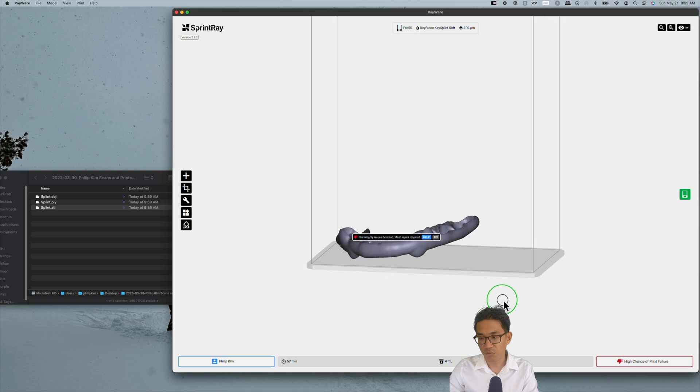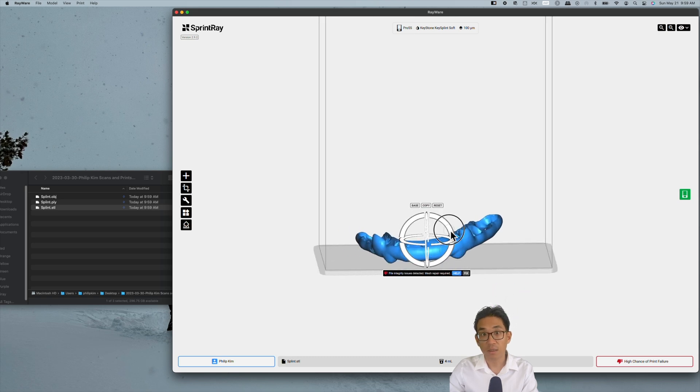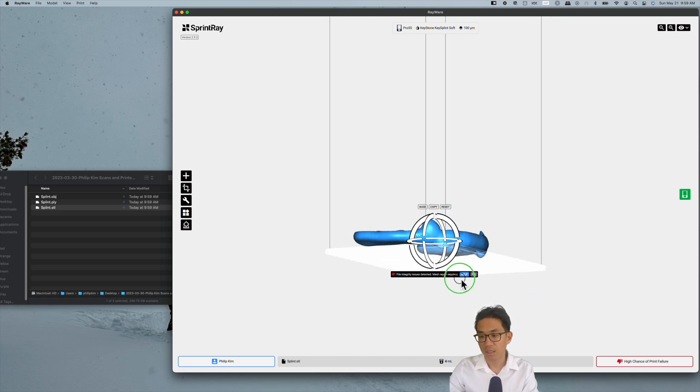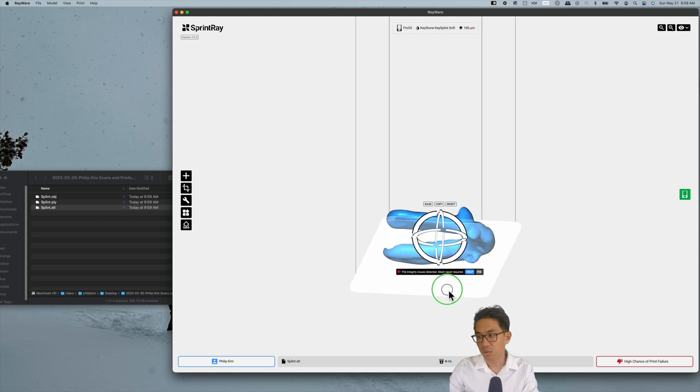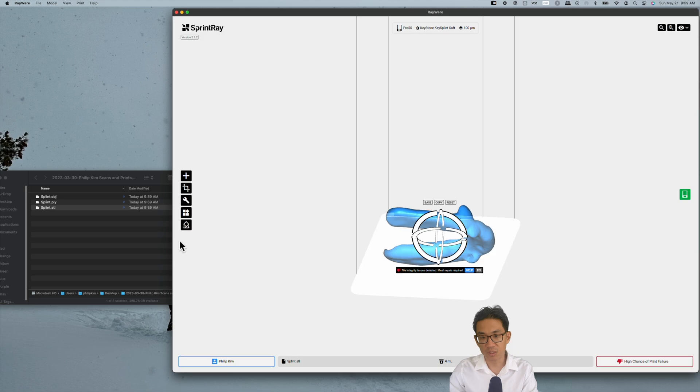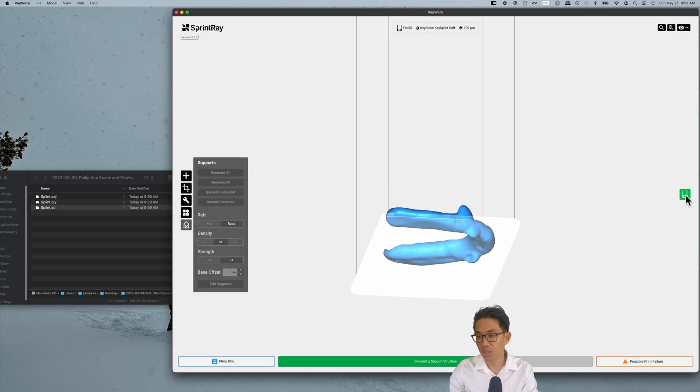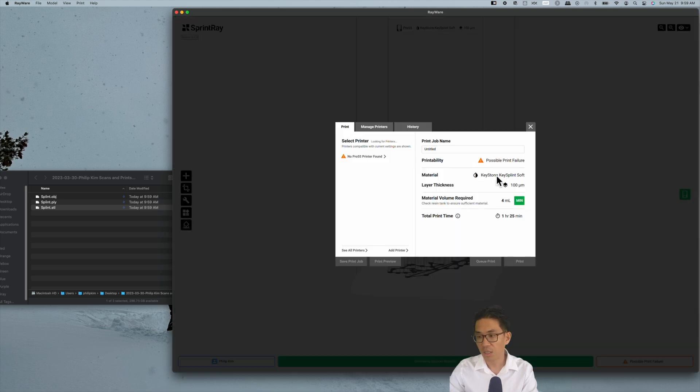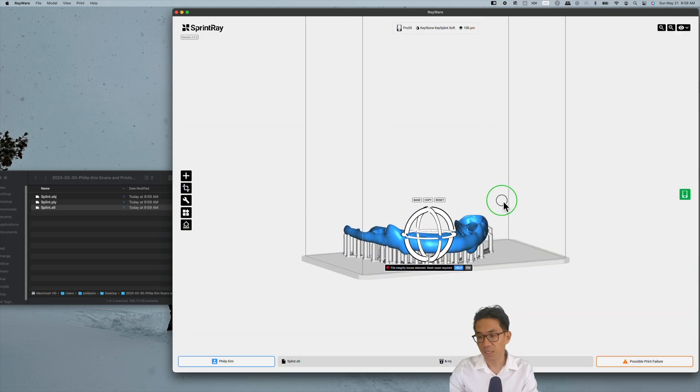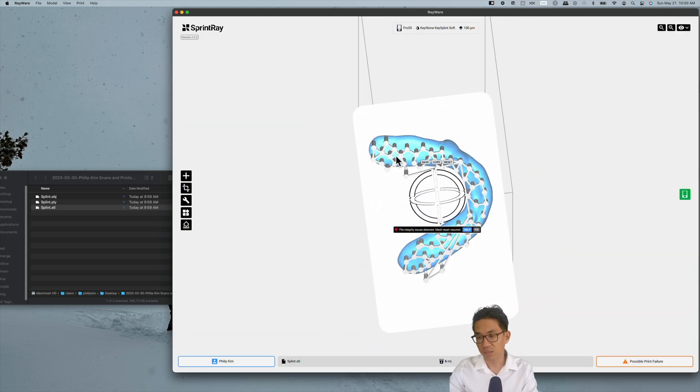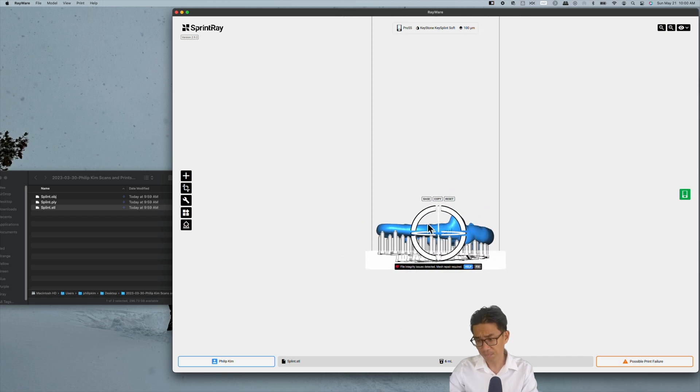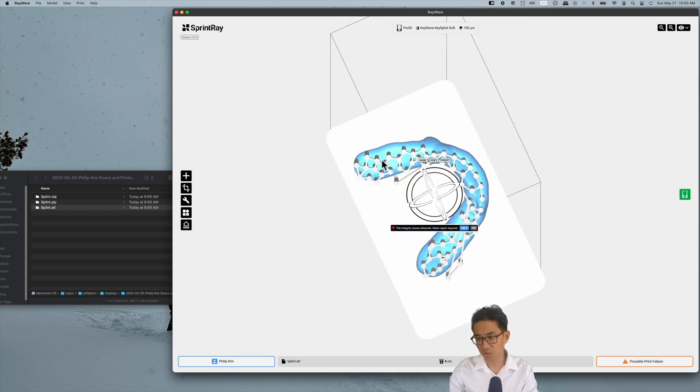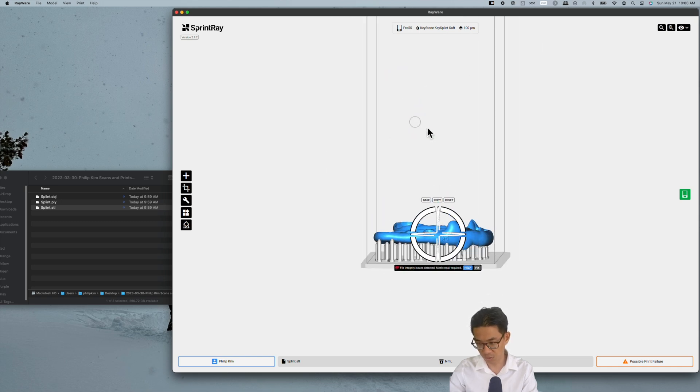When it comes to printing, if you print completely flat, the print time will be 51 minutes. You add supports, print time will be an hour and a half. The issue with that is you have all these supports at the bottom on the occlusal surface which you need to remove and then adjust and dial in the occlusion, which can take a considerable amount of time.